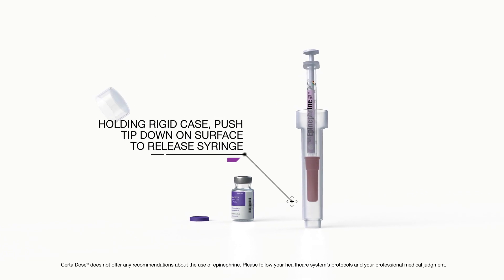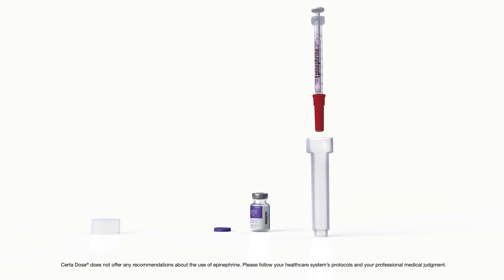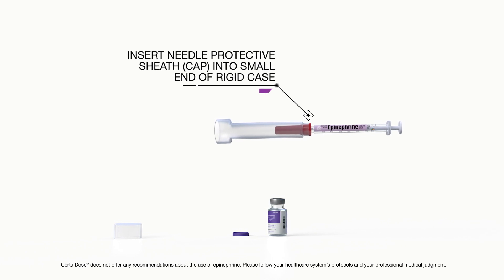Holding the rigid case, push the tip down on a surface to release the syringe. Insert the needle protective sheath into the small end of the rigid case.